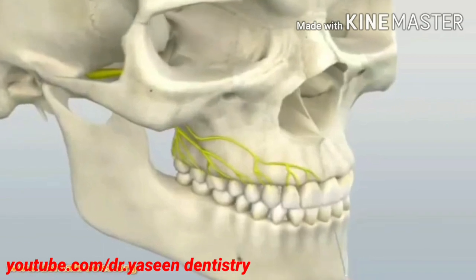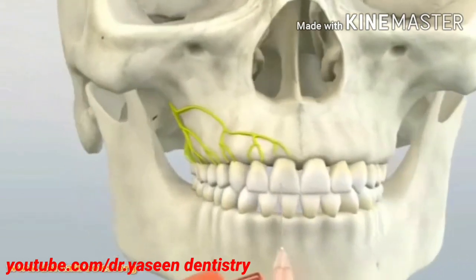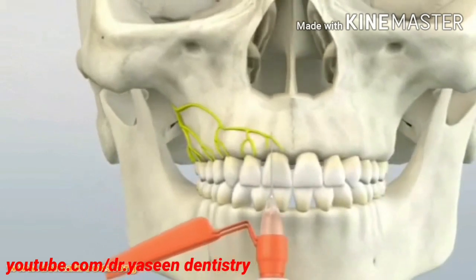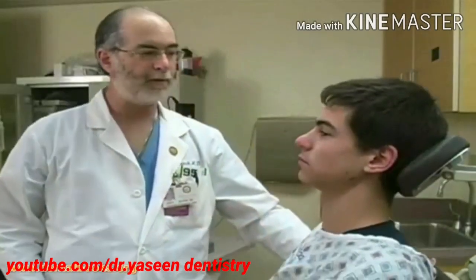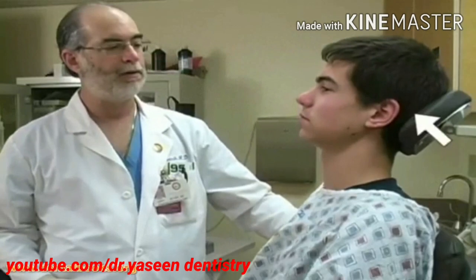The supraperiosteal infiltration is the most common technique for local anesthesia of individual teeth and may be used to provide complete relief from a toothache. Position the patient sitting upright in a dental chair or stretcher so that the occiput is firmly supported and the body of the mandible is parallel to the floor when the mouth is open.